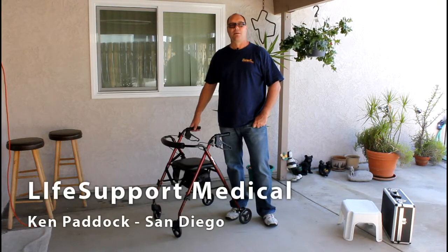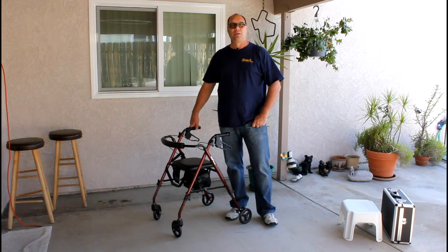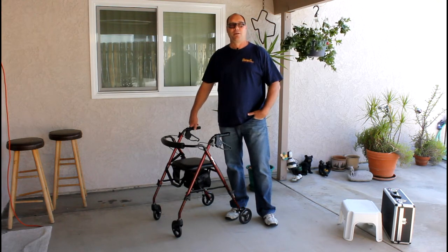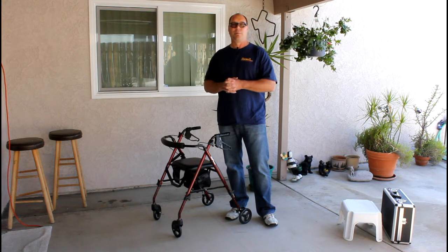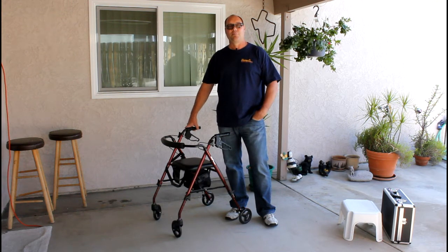Hi, everybody. My name is Ken Paddock. I'm with Life Support Medical San Diego. And today I wanted to discuss a great opportunity to get to know a senior. Most seniors have walkers, and this is a way for you to approach a senior and offer a good-faith gesture, as well as give them some technical assistance with their walker — what we're talking about is a walker maintenance tune-up.